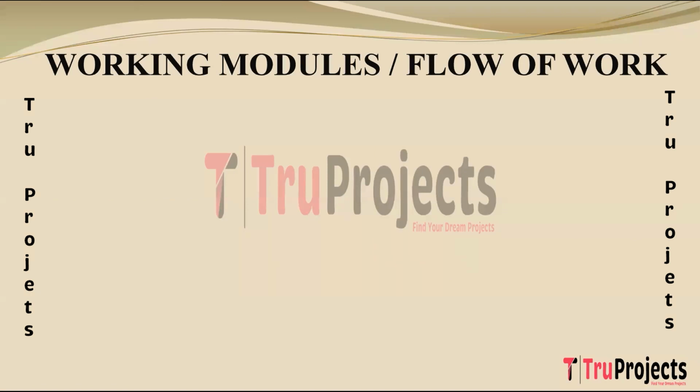Working modules or flow of work. To implement this project, we have designed the following modules. The first module is importing the packages. This module involves importing necessary libraries and packages in the chosen programming environment. These include libraries such as NumPy for numerical operations, Pandas for data manipulation, Matplotlib or Seaborn for visualization, and frameworks like TensorFlow or PyTorch for deep learning implementation. Importing packages sets up the groundwork for subsequent data handling and model development.